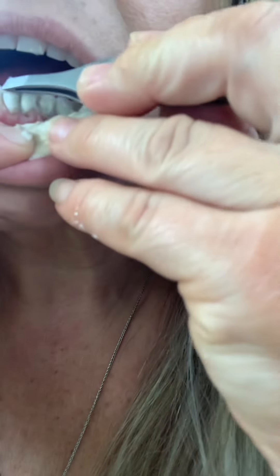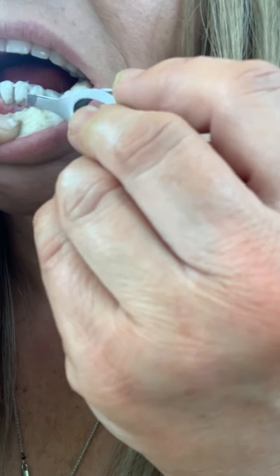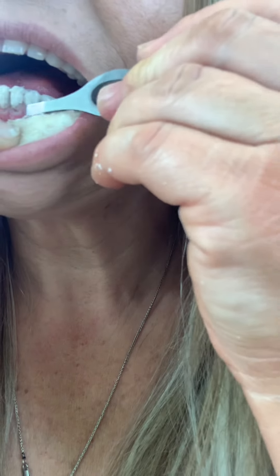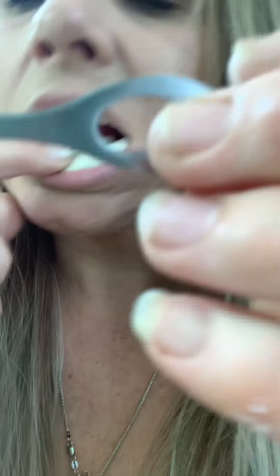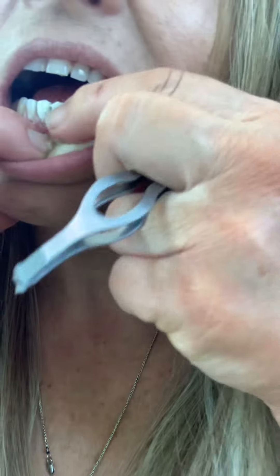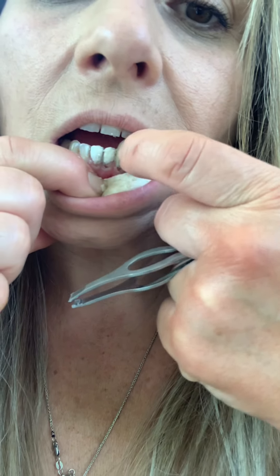It's like a white putty. You normally want to put floss here. So I had a tip missing right over here.